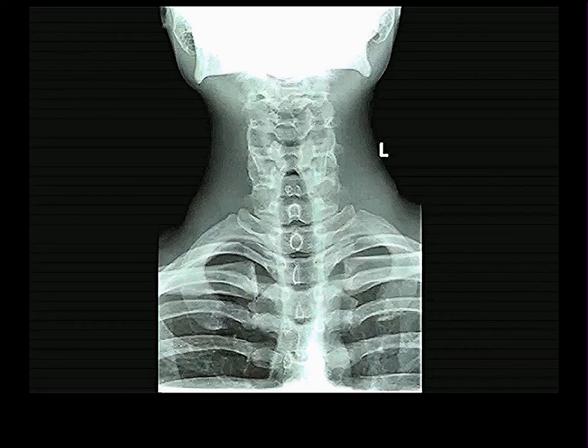I can sort of see that there must be vertebrae there of some sort or the other, but I can hardly tell one from the other. In fact, the only thing I really see on this AP view of the neck is the spinous process of C7. You know, cervical vertebrae except for C7 have bifid, that means branching, spinous processes, and C1 doesn't. C1 doesn't have a spinous process at all.